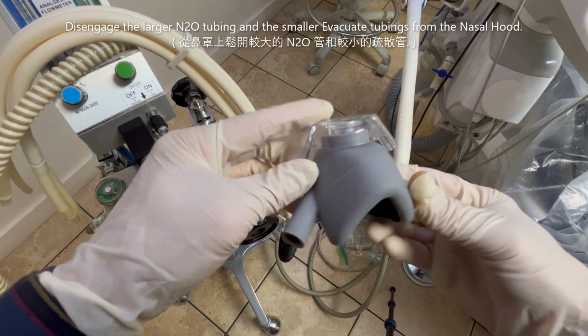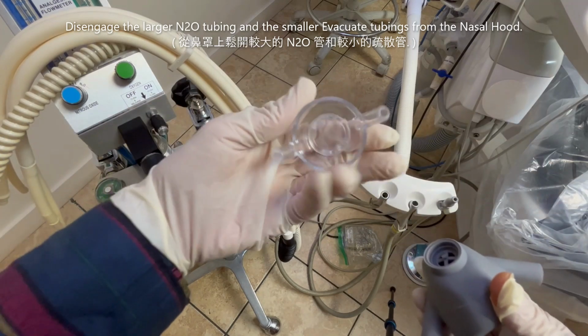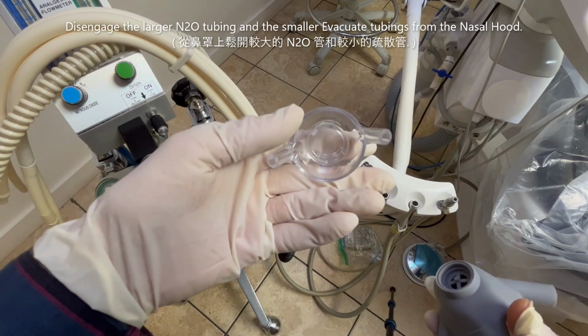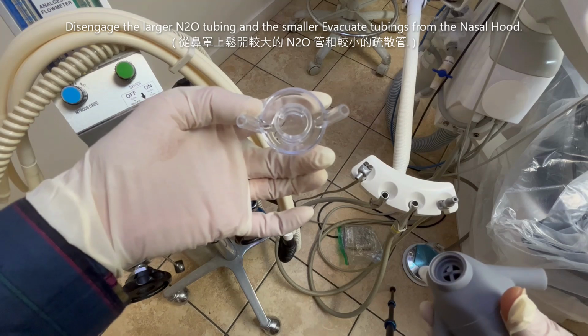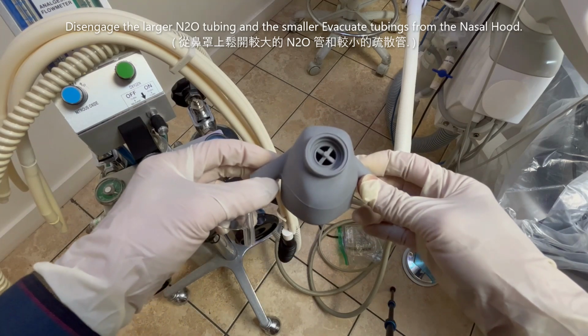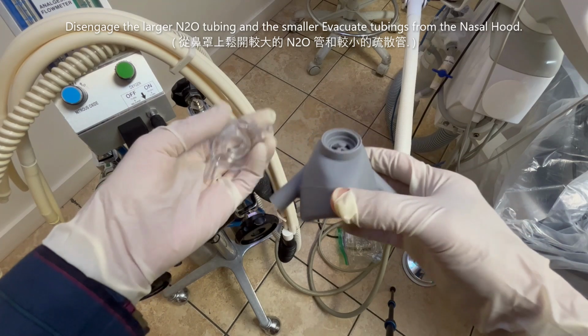This plastic nose piece, you can disengage, separate it. This is cold sterilization. It will melt if you put it in the autoclave. So never put this in the autoclave machine. Cold sterilization overnight. This, you can put in the autoclave machine and autoclave it after you wipe it.